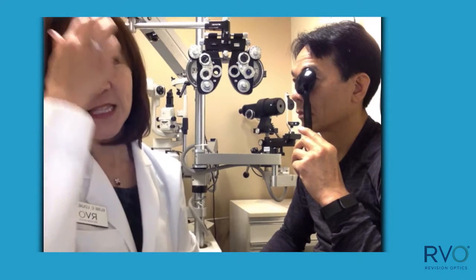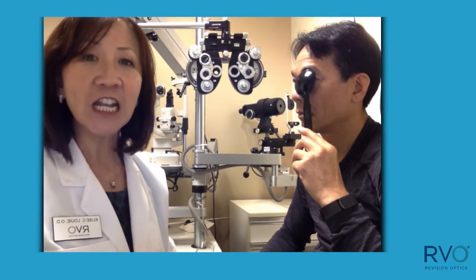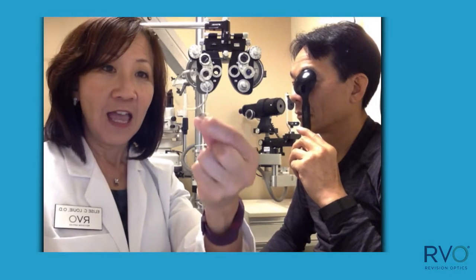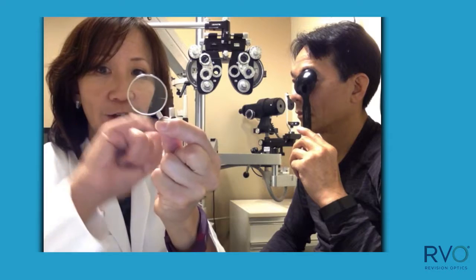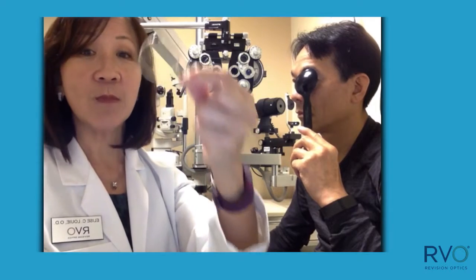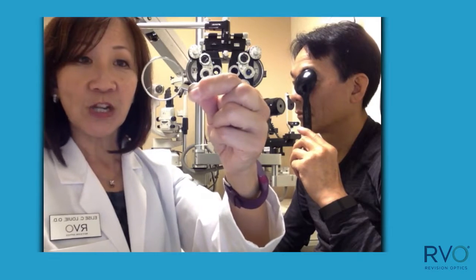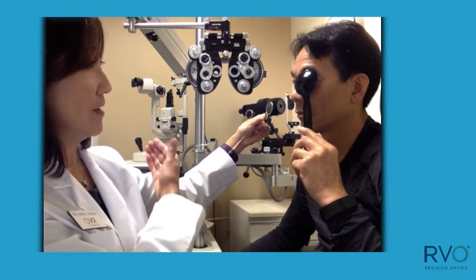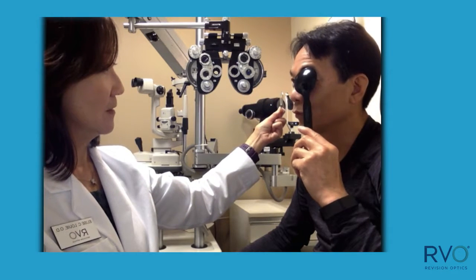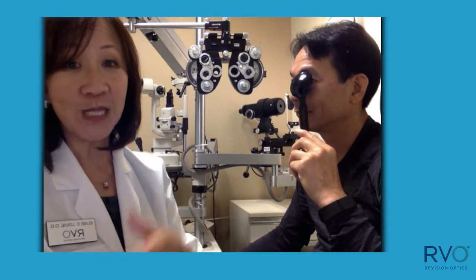Now, sometimes it's not uncommon to get an inaccurate astigmatism measurement behind the phoropter. So if you get an unusual cylinder response, verify it in free space. Here I have a cylinder lens — you can see the axis lines here. I'm going to angle this to the cylinder response from the phoropter. In his case it was minus one, axis 30. So I angle this to about axis 30 and show him the cylinder response. Do you prefer with or without? I prefer without. This is a really quick and easy method to determine whether the cylinder is really there.